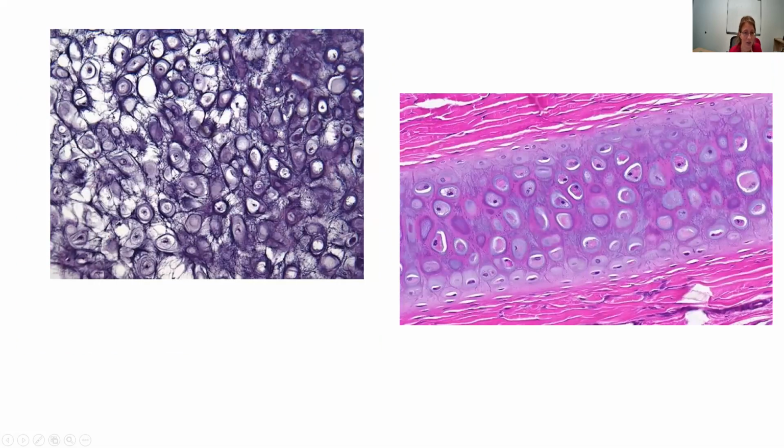Okay, these are actually the same thing. And I put this picture on the left because I think it's evil. But I wanted you to see the evil as well as the not so evil. So I might look at this over here and I might be tempted to call this like reticular tissue or something. Okay, first off, I don't see an edge. So I know I'm not in epithelium. I don't see any kind of striations or anything that looks like muscle tissue in this section or over here. So I can throw out muscle.